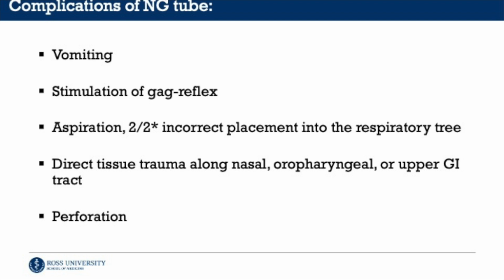Avoidance of prophylactic postoperative nasogastric decompression decreases pulmonary complications and has other beneficial effects. Intubation of the lung and inadvertent administration of medications, radiocontrast media, or enteral formula through the mispositioned tube could lead to pneumonia, pulmonary abscess, and even tracheal perforation and pneumothorax have also been reported.